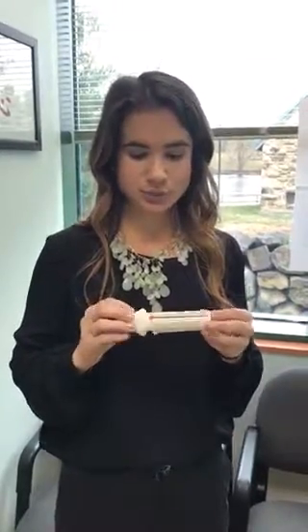My name is Taylor. I'm a PA student, and I'm going to show you about a peak flow meter. So this is a peak flow meter. It's used to monitor different conditions like asthma. And so what you do is you breathe into it.